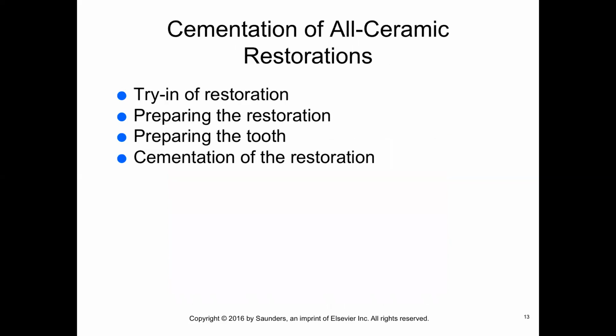Delivering the restoration has 4 steps. Removal of the temporary crown or bridge is first. Care must be taken when removing the temporary because some preps may include a buildup of resin and pins, and this can be pulled out. You then clean the tooth surface of the remaining temporary cement and debris with a microbrush, and hard to remove pieces with the scaler only if the tooth has had a root canal. Can you imagine scaling a tooth that is still vital? I mean, the exposed dentin, that patient would jump through the roof.